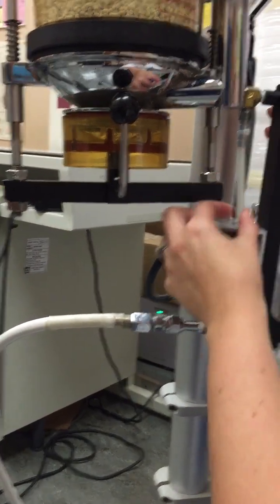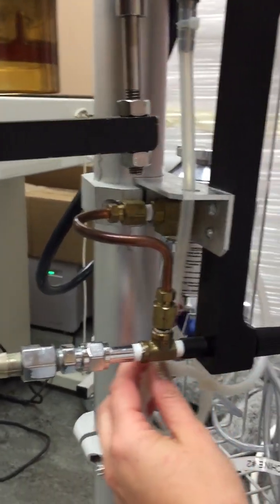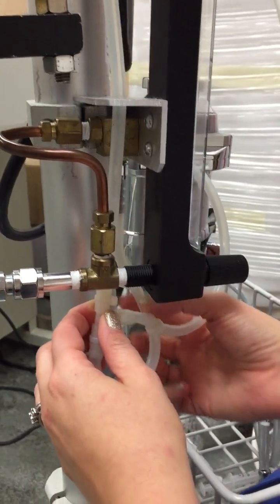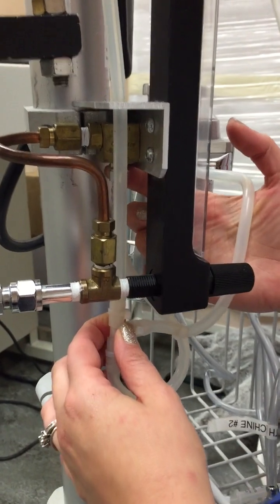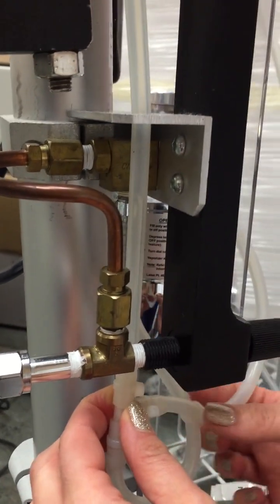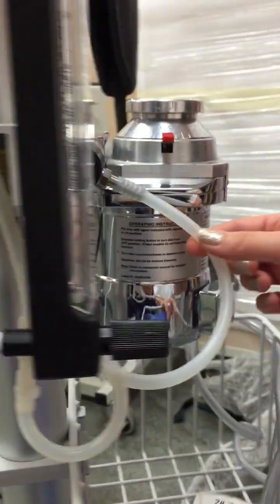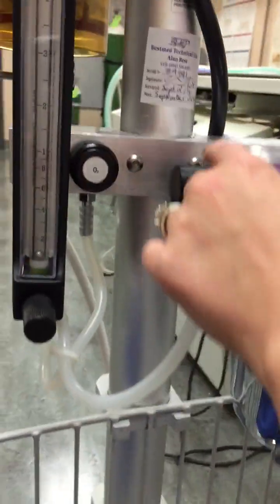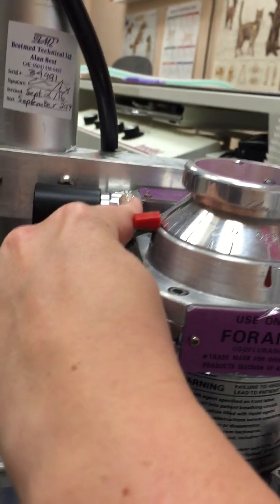With the flow meter on, the oxygen is going to now come up here and then come out this hose. You'll see it can go a few places. So it's, again, another tube to take it to the oxygen flush if needed. And then there is this hose here that will take it to your vaporizer inlet. So if you look here, it actually says at the top, vaporizer inlet.